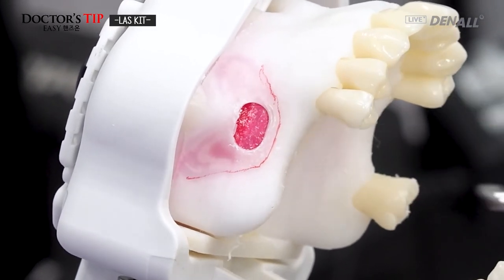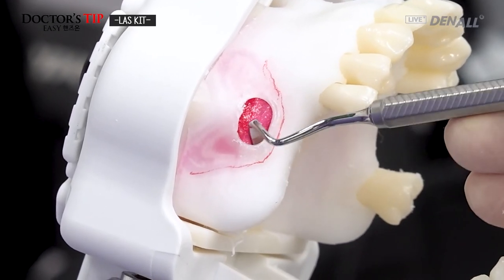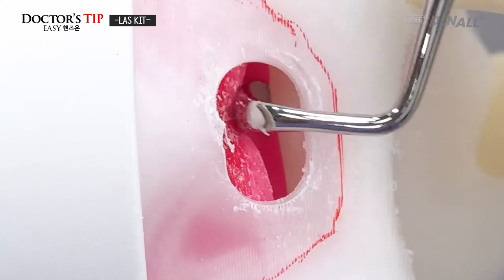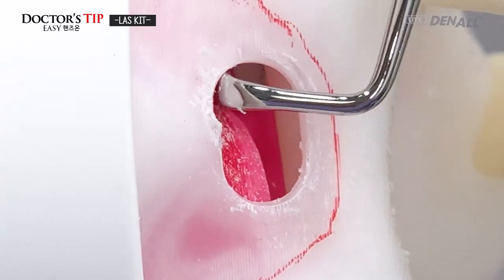Then the sinus membrane will be fully elevated. On the distal side, you fully detach. Then the sinus membrane is fully detached. Even on the inner side, you see there is a full elevation.